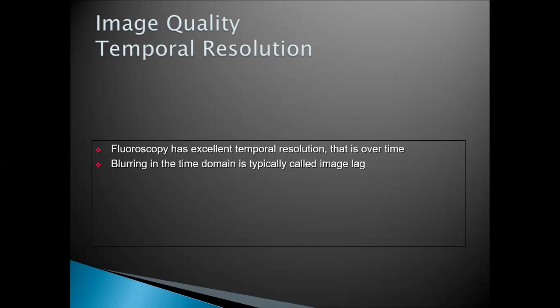The monitor or the system one is using also has a role to play because they have their own resolution. So blurring is typically a problem with temporal resolution. If you have blurring in a particular video, then it means the temporal resolution is bad because the information of a particular event is carried over to the next event.